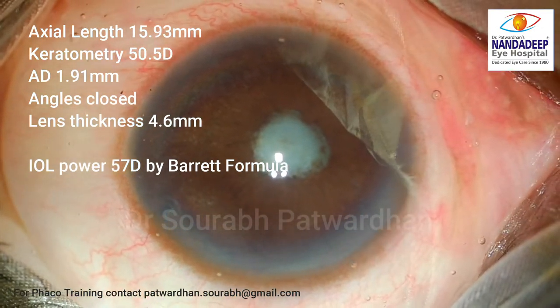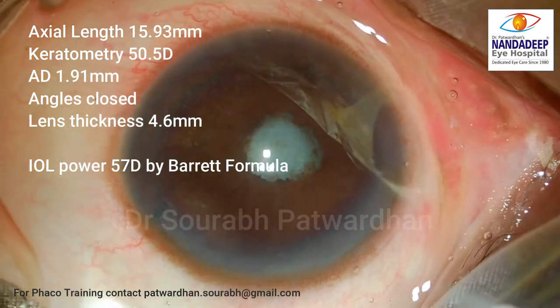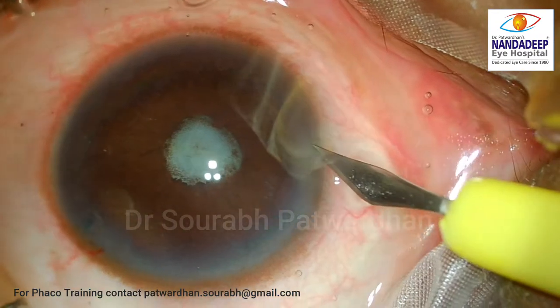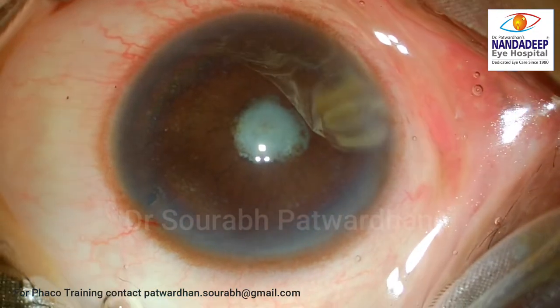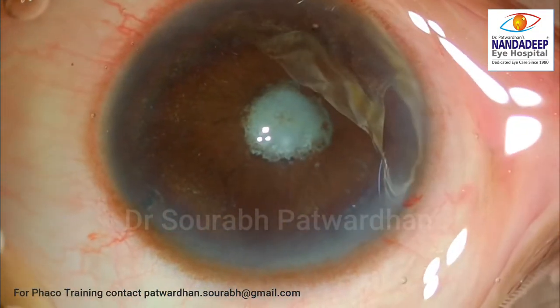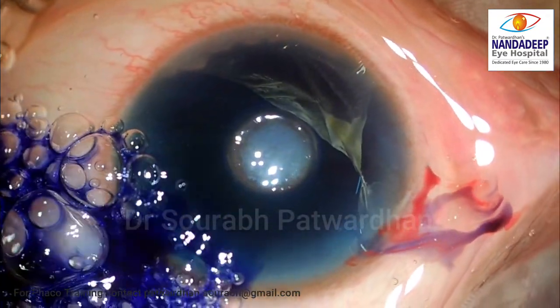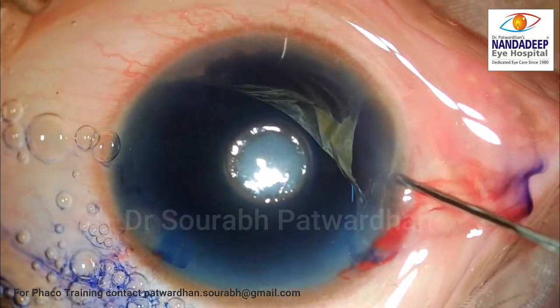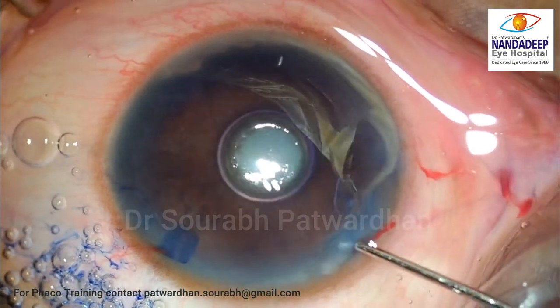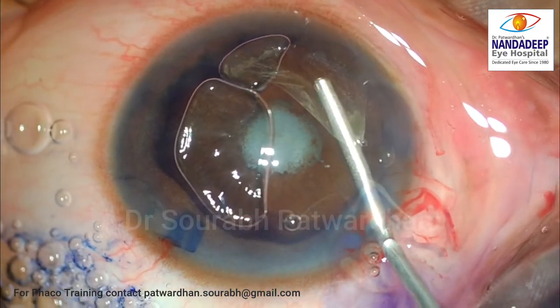You can see the aqueous depth is just 1.91 mm, angles are closed, and IOL power calculated by Barrett's formula is 57 diopters. Of course, for small eyes no formula is exactly accurate, so we have to check multiple formulas. I also checked the Haigis formula, HofferQ formula, and Kane formula. HofferQ gave IOL power of almost 60 diopters while Haigis gave IOL power of 50 diopters.